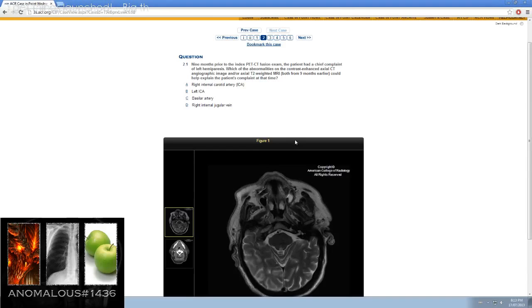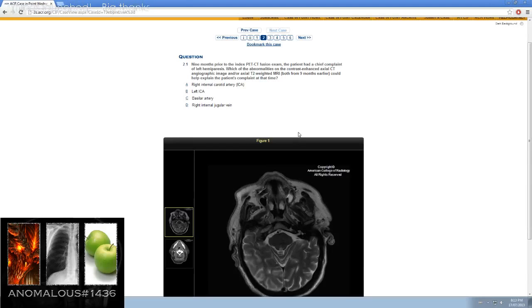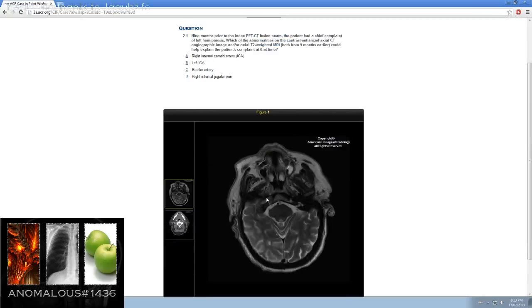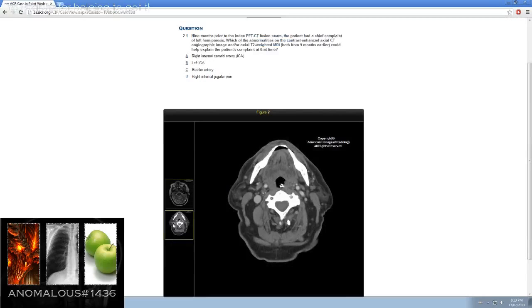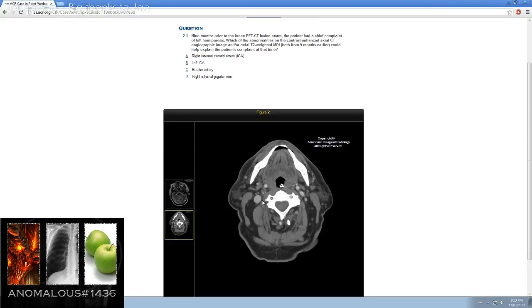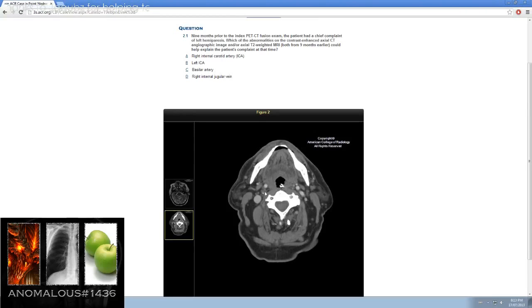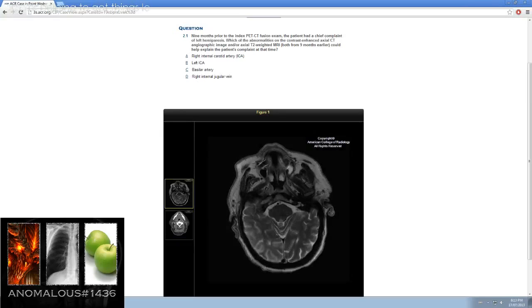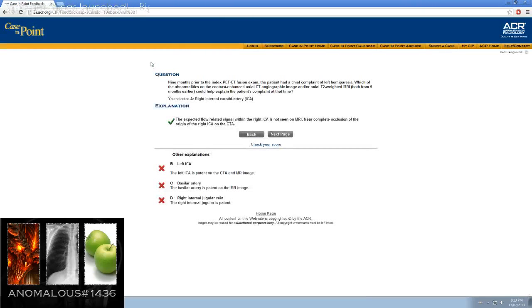Right internal carotid artery, which I think is a little odd here. Different flow void here. Left ICA, basilar artery, right internal jugular. Here we have vertebrals. You can see the vertebrals on this CT here. Let's go to the right ICA.